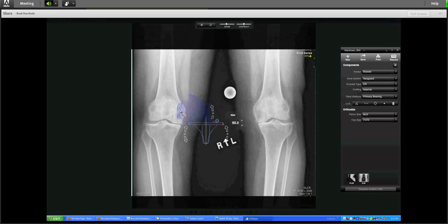And now let's actually template the side that the patient came in for before I get sued for malpractice. Now remember, this was a 65, and that's what came in because we had templated for a 65. But we were kind of concerned on the lateral view that it seemed to be a little big. Here on this AP view, I think you could argue one way or the other. Maybe the osteophytes are what's giving us the issue here. So let's keep it at the 65 this time.